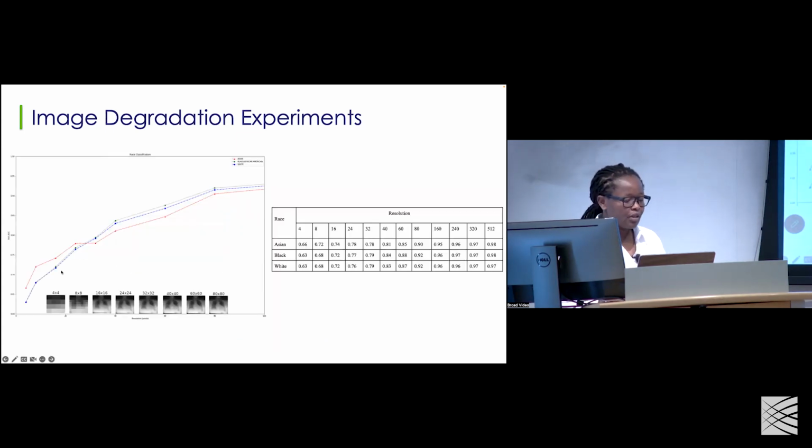And so in this work, we start to see this downgrading of the pixels, right? This is a 4x4 chest X-ray. We still see, well, the performance is not in the 0.9, but we see this is 0.6. But this is barely perceptible. This is not a chest X-ray to any radiologist.